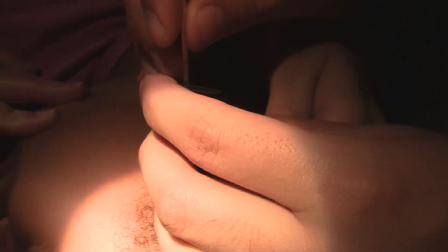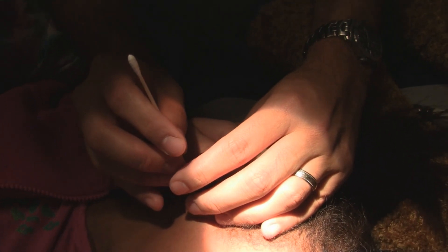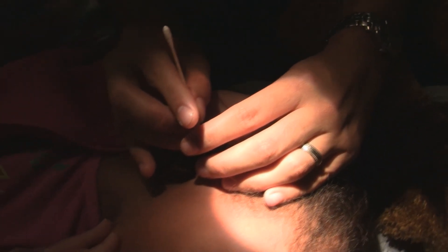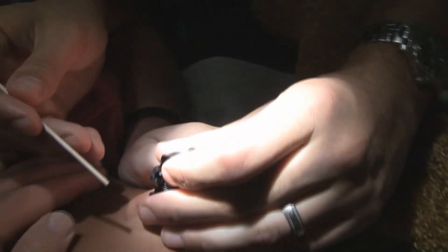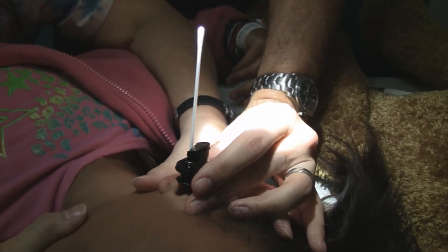Just hold really still so he can get just where he needs to be. Good job, keep holding still. You're just going to feel it. Just hold still — good job, you're doing great. We're just laying it right there.